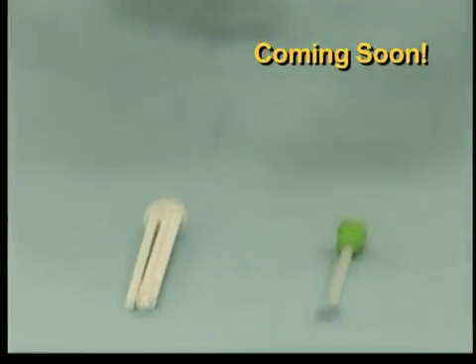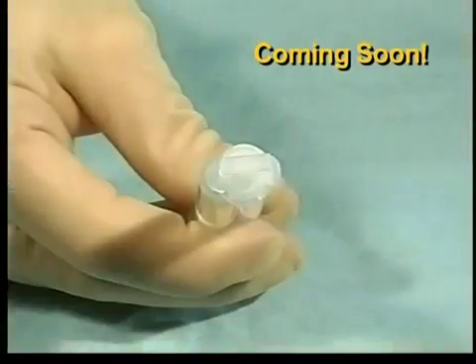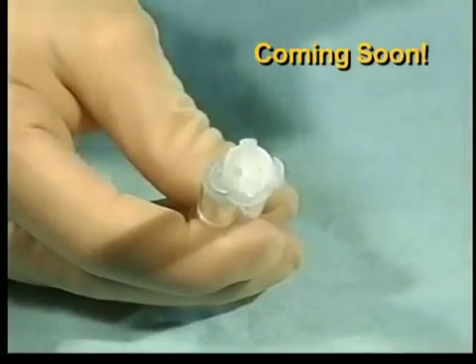Hold the syringe upright and tap until the air bubbles rise to the top of the solutions. To remove the cap, rotate it 90 degrees counterclockwise and gently lift it from the syringe.